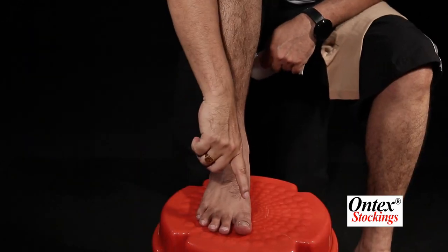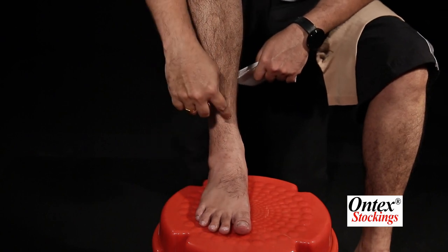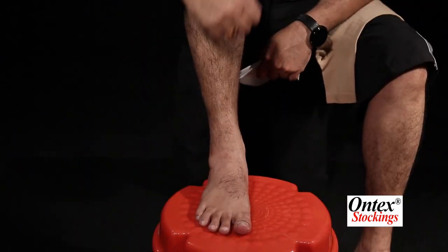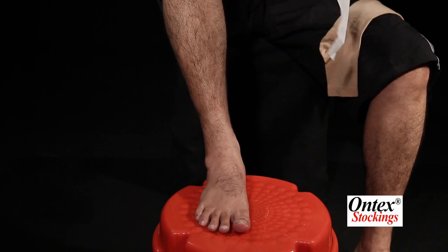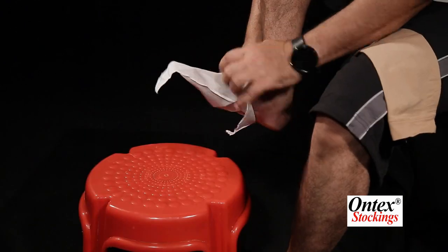Please ensure that the nails are cut periodically. Ladies, please avoid wearing anklets or any finger jewels. You can apply some talcum powder in order to smoothen the wearing, and you can also wear this stocking aid.